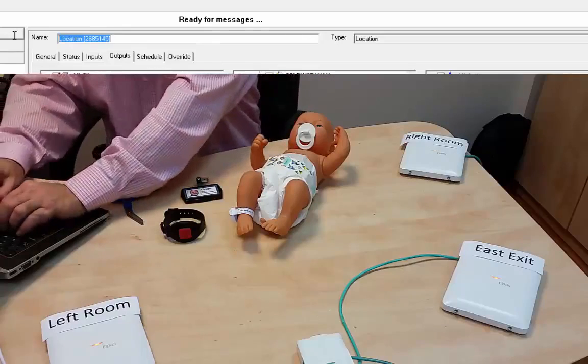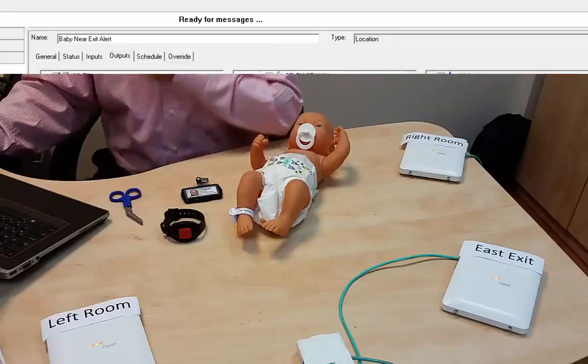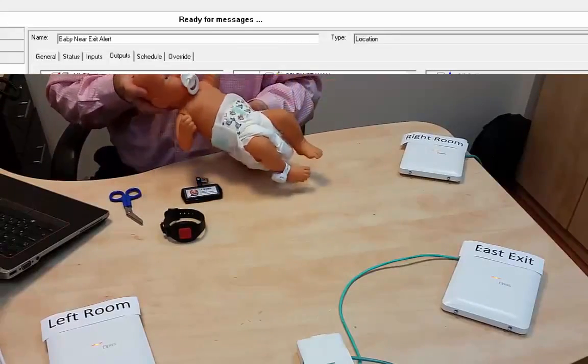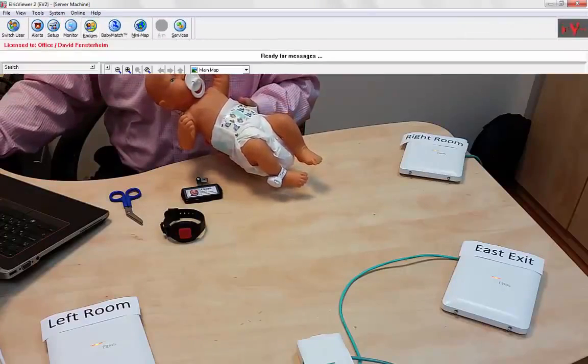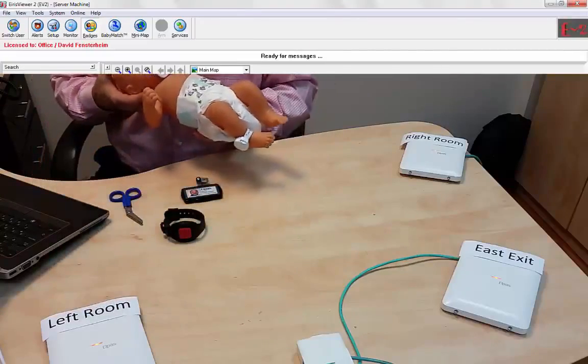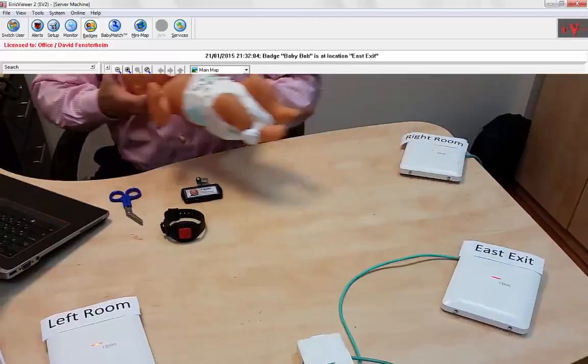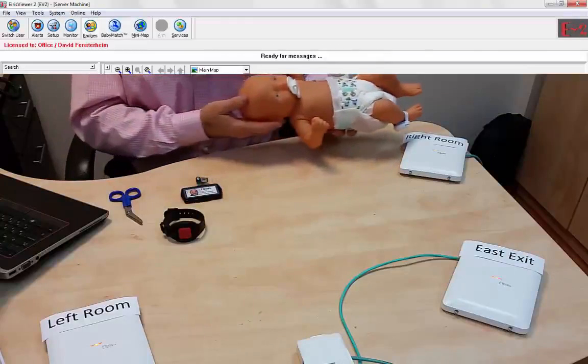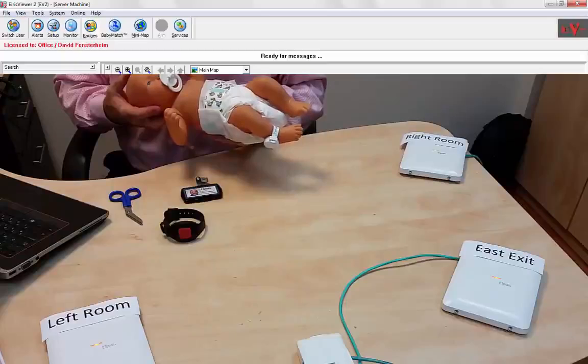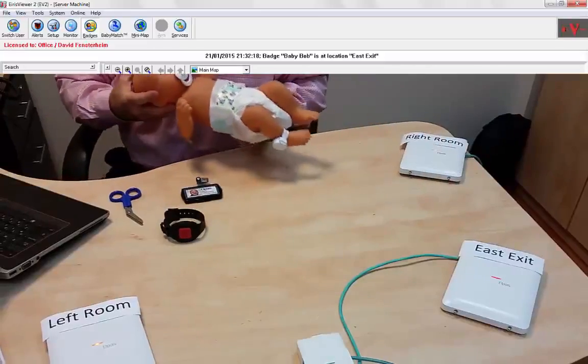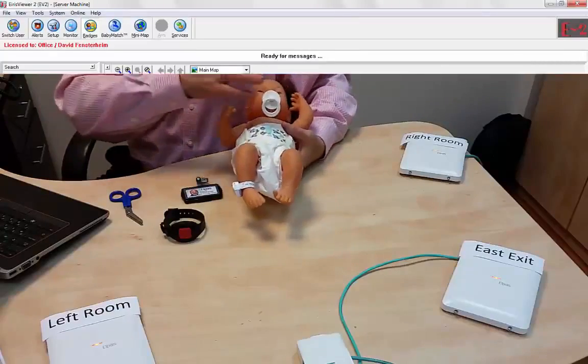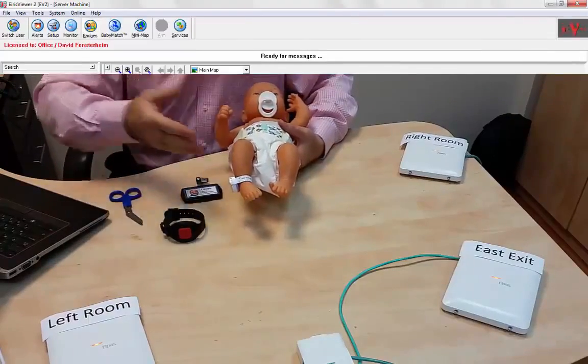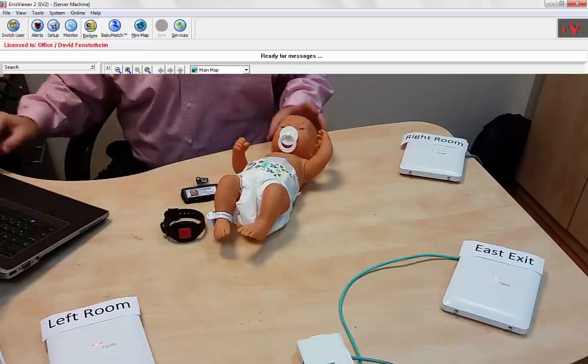So, if I take baby Bob, let's look at his location now. His location is in the west wing. Well, that's left room. Let's move him back into left room, let's say. And put him in the exit, and I get the immediate alarm. Pay attention to the speed at which it alarms. This thing is listening every quarter of a second for that message. Baby near exit. As soon as it relocates, we get that alarm, and we can lock the door. Of course, you can adjust the range of these beacons to anywhere up to five meters. And it's quite accurate.